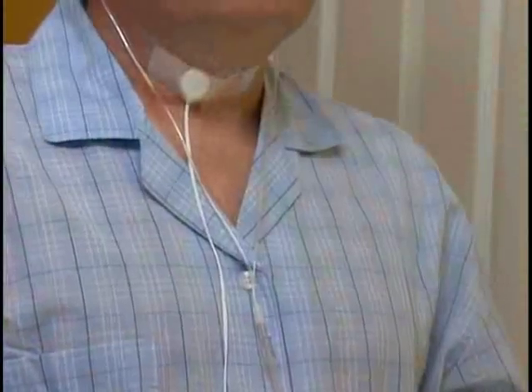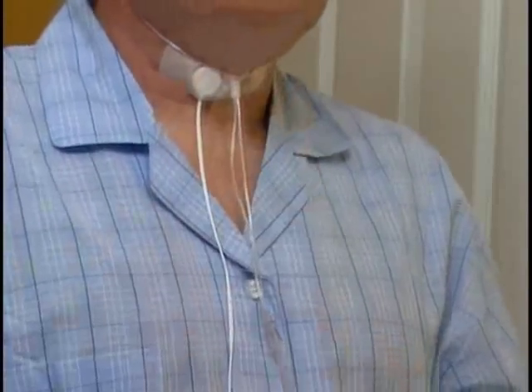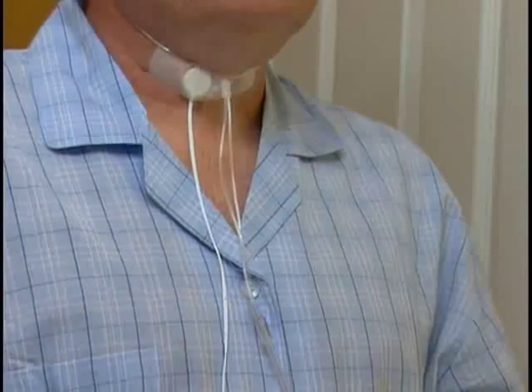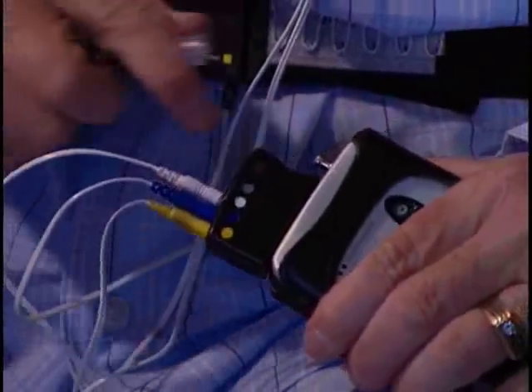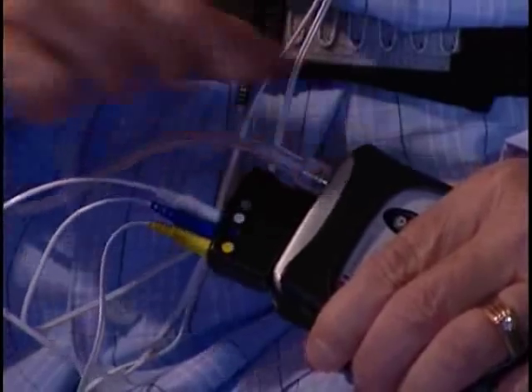Place the prongs in your nostrils. Loop the tubing around your ears, then position the tubing under your chin and tighten the prongs into position by pushing the bolo slide or toggle towards your chin. The nasal cannula is plugged into the luer lock on the Embletta unit. Twist clockwise to tighten.